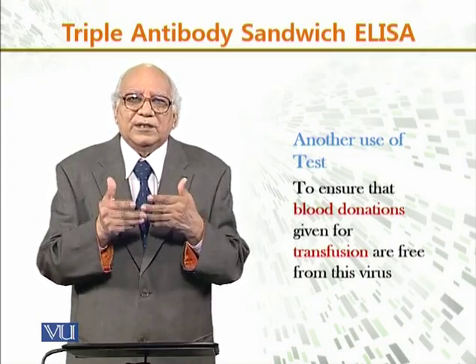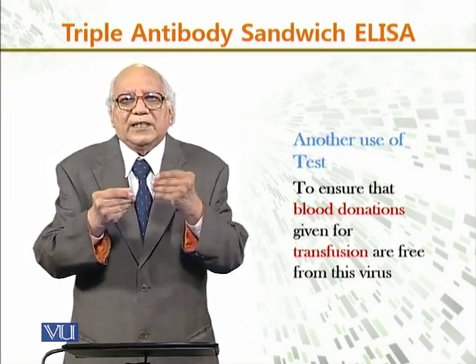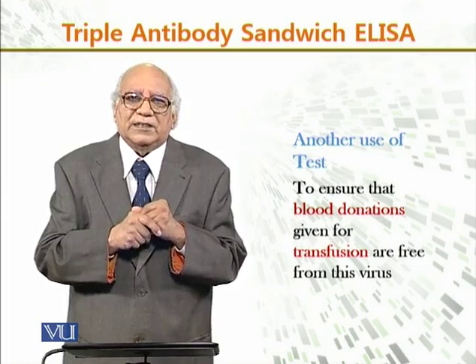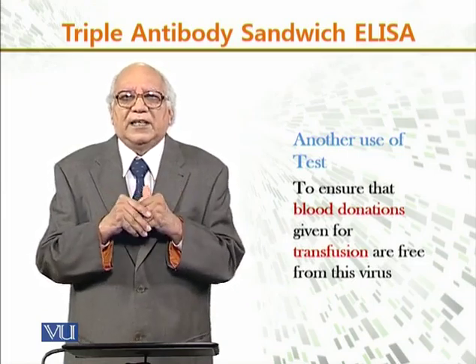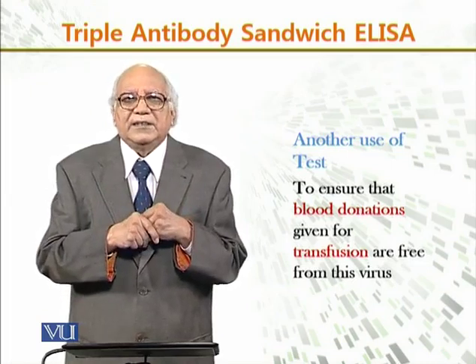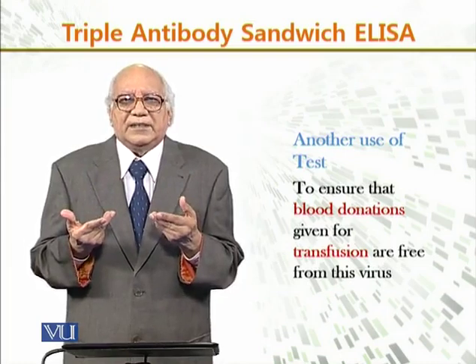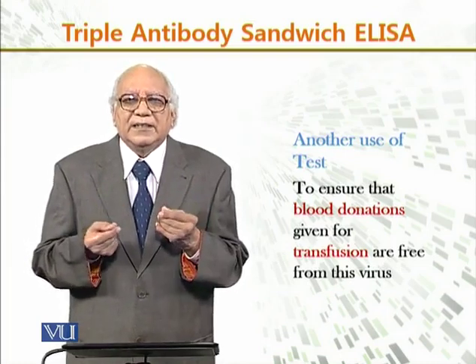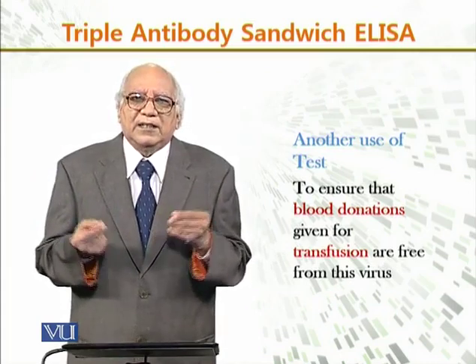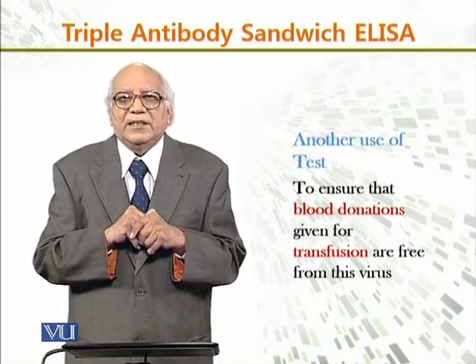If it is free, we can use it in the blood bank for further transfusion, which helps us a lot to make HBV-free donation. So you see that the indirect ELISA method has played a significant role in the diagnosis of HBV.